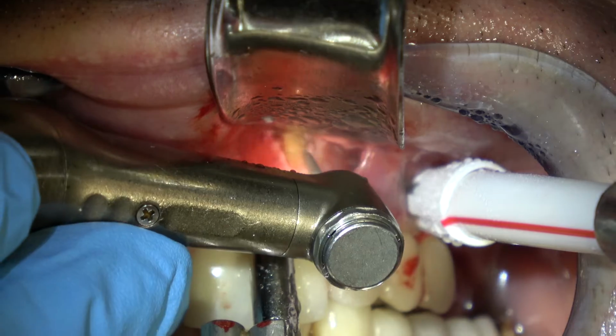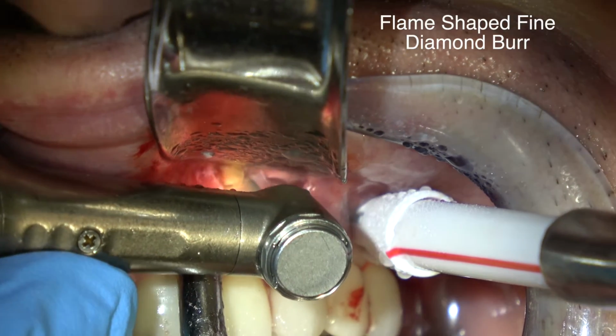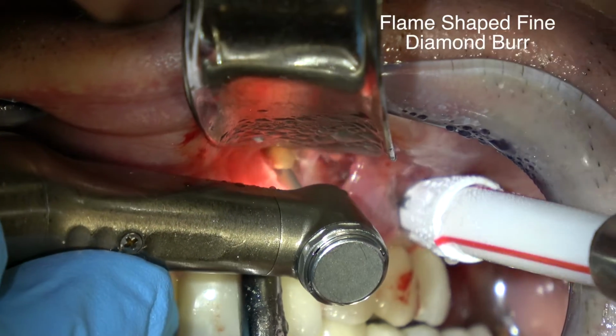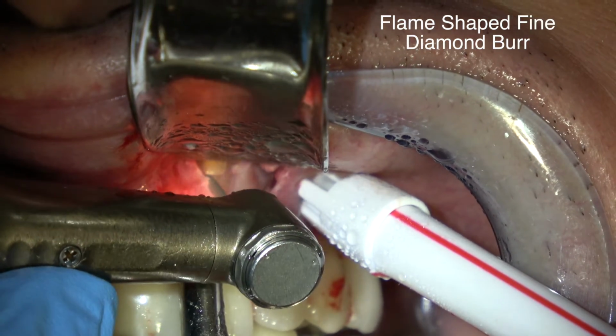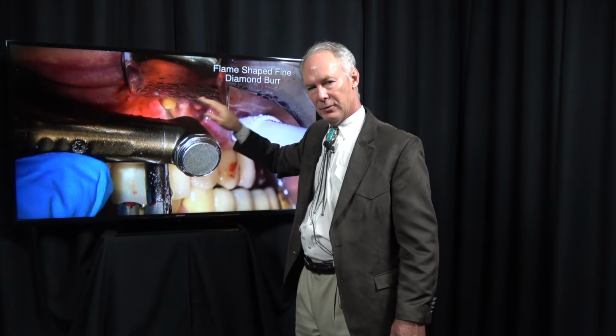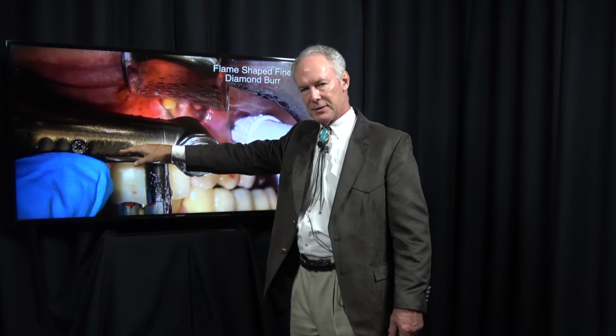Okay, now this is a flame-shaped fine diamond burr. I'm cutting through the root of the tooth. I'm probably 3 to 4 millimeters from the apex of the root, and you'll notice I'm cutting at a bevel. Now be sure you get all the way through the root of the tooth. Actually go into the alveolar bone just a bit on the other side of the root to be sure you've cut through it completely and don't leave a little lip of tooth on the palatal aspect.